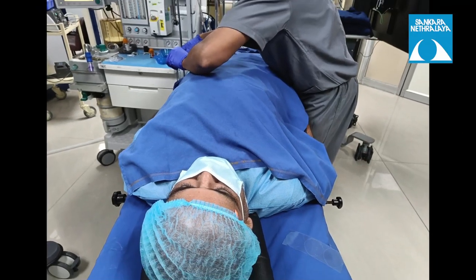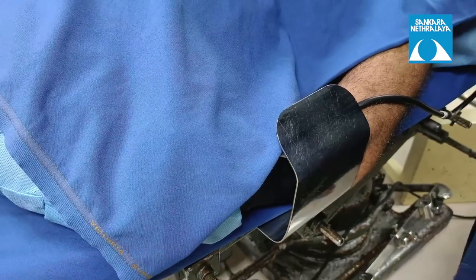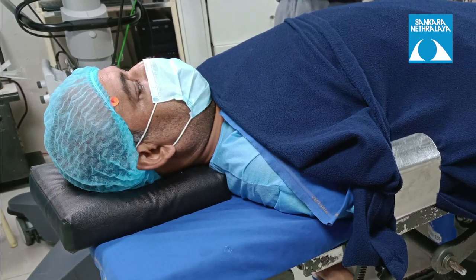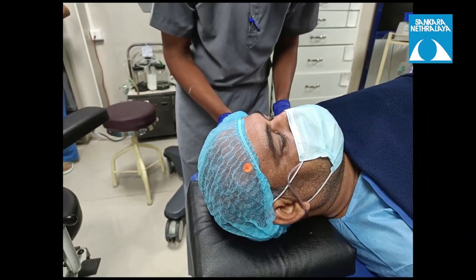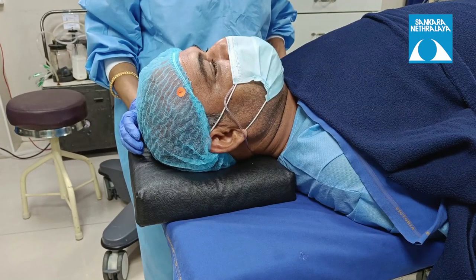The first thing is to make sure that the patient is lying comfortably straight on the OT table with arms resting inside the arm guard. The head must be supported by an adequate sized headrest, which is especially important in patients with neck problems like spondylosis. Comfortable positioning is important as vitreo-retina surgery may last for approximately two or more hours, unlike cataract surgery.